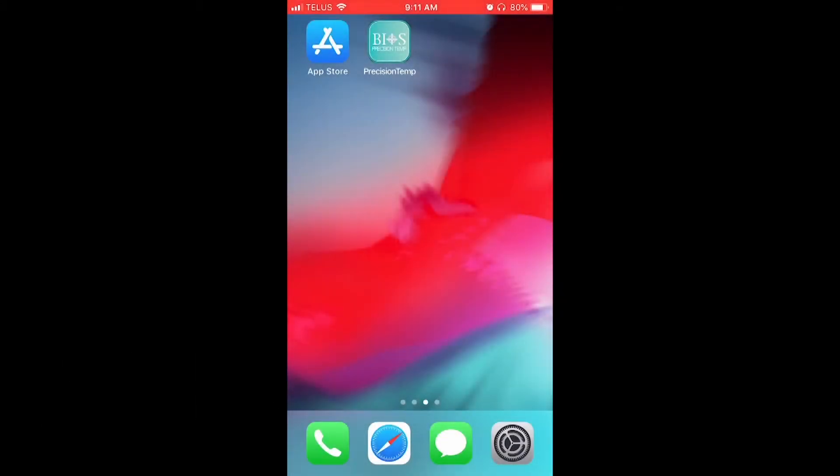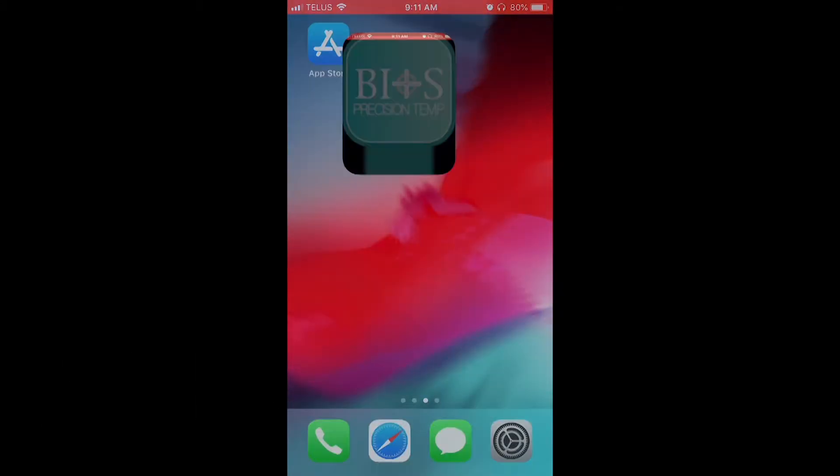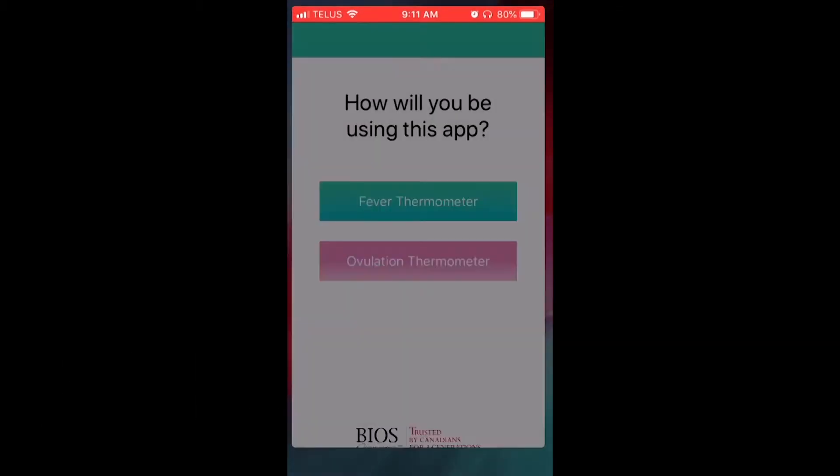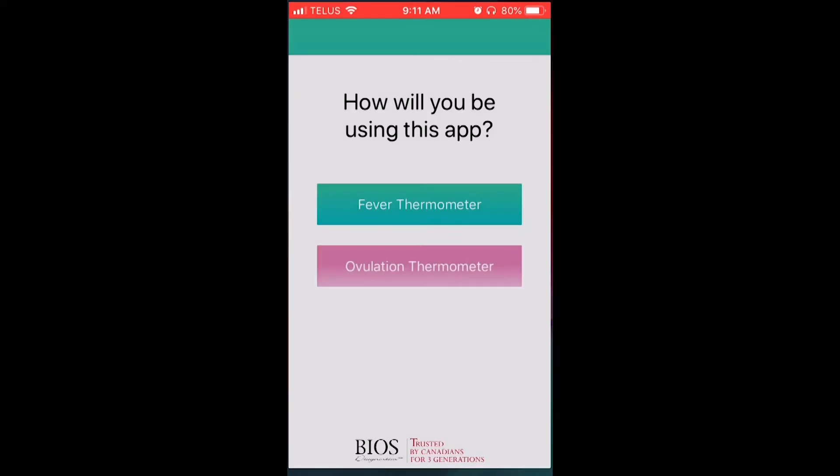The Precision Temp app was designed for different thermometer uses. Select either the Fever Thermometer or Ovulation Thermometer button based on the app you would like to launch. In this tutorial, we will be demonstrating the Fever Thermometer app.